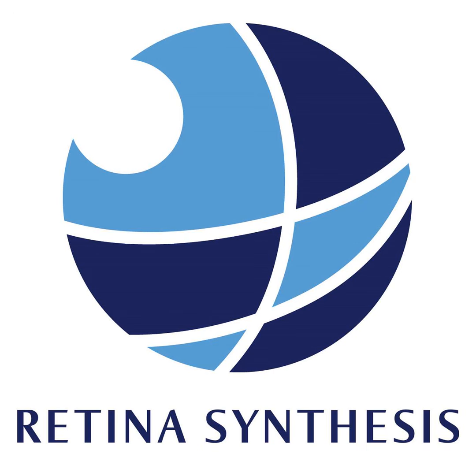So if we just talk about progression of drusen to geographic atrophy, en face imaging is really, really powerful. We can not only image the drusen on an en face projection, but we can measure the area and the volume of the drusen. And as you know, we've used that in spectral domain OCT imaging to identify risk factors for disease progression, just based on the volume and area of drusen in the central macula. We've got a pretty good idea which eyes are going to progress to that next stage, which is geographic atrophy.